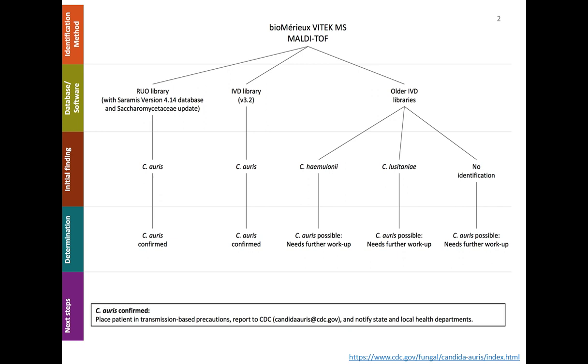And with the Vitek MS, and this is true of the other MALDI-TOF systems as well, it's no longer going to misidentify that organism as haemulonii or lusitaniae. So a haemulonii or lusitaniae call on that system can now be reliable.